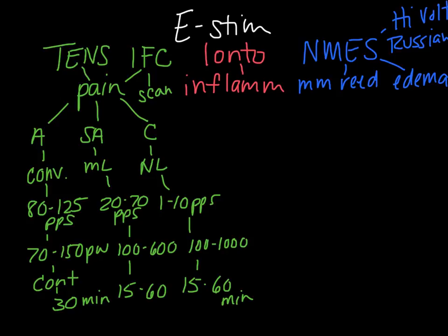So moving on to Ionto. Ionto is pretty straightforward, and again, iontophoresis is used to deliver medications using electrical stimulation.